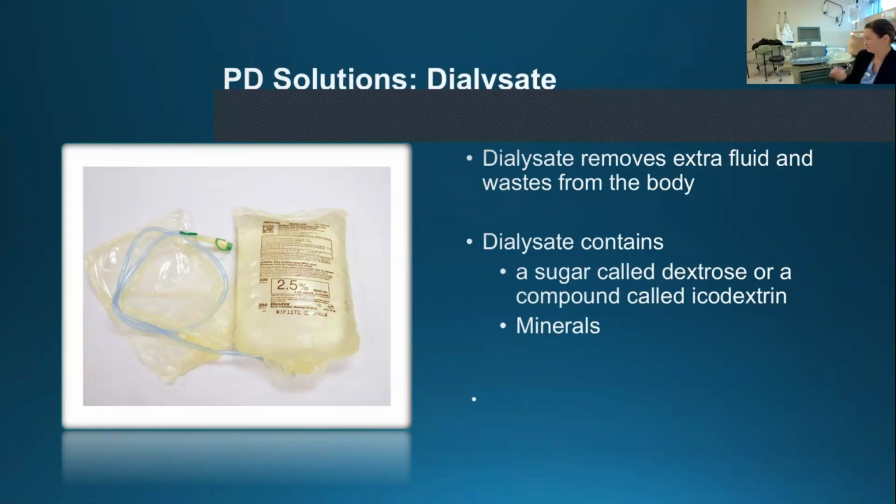So the PD solution, which is in here, removes extra fluid and waste from the body. The dialysate contains a sugar called dextrose, or a compound called icodextrin. And it also contains some minerals: calcium, magnesium, and sodium.